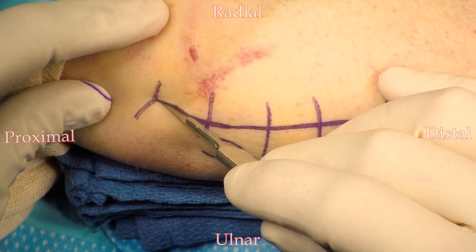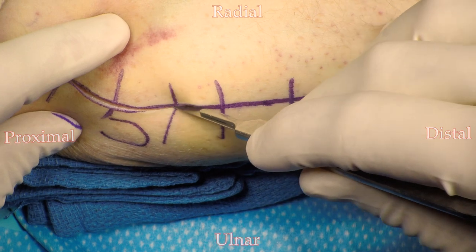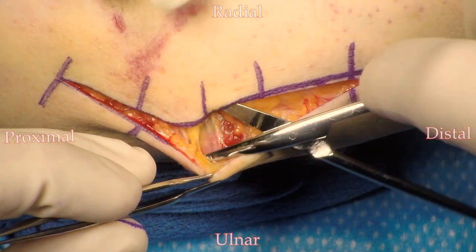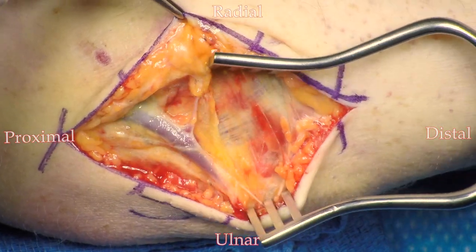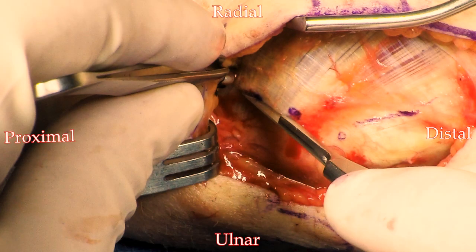The incision is placed approximately 2 centimeters volar to the medial epicondyle and extended distally in line with the ulna. You do want to watch carefully for the branches of the medial antibrachial cutaneous nerve. The incision in the flexor pronator mass can be started on the supracondylar ridge and then taken distally between the FCU and the palmaris. You do have the option of starting at the medial epicondyle and just going distally between palmaris and FCU. I do find it a little bit easier, if you're not as comfortable in this area, to start on the supracondylar ridge — it makes your initial dissection a little bit easier.